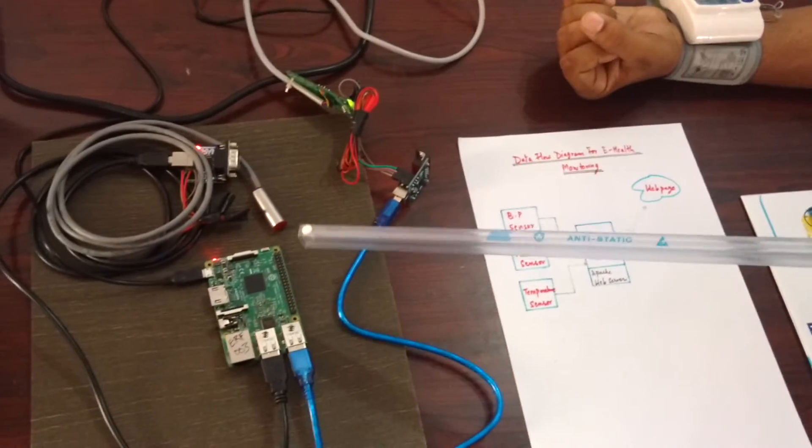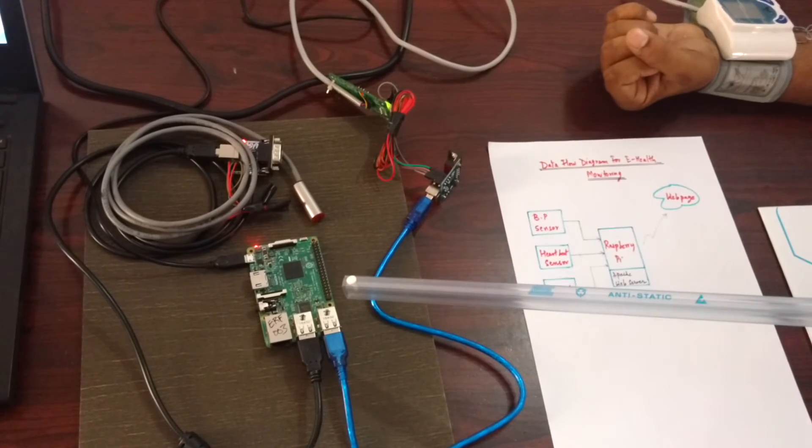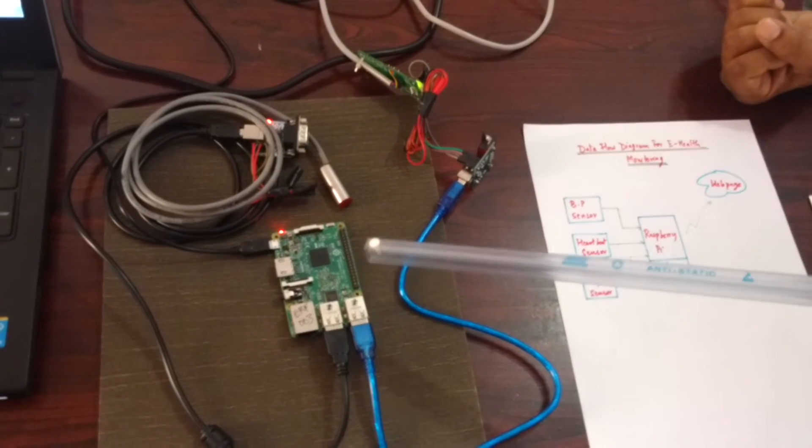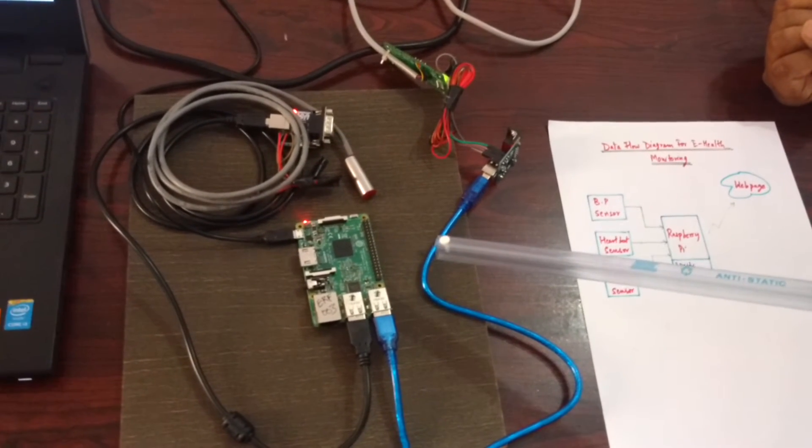This is connected to the Raspberry Pi through USB and Raspberry Pi is connected to the router through Wi-Fi. We are using a Raspberry Pi 3 here.